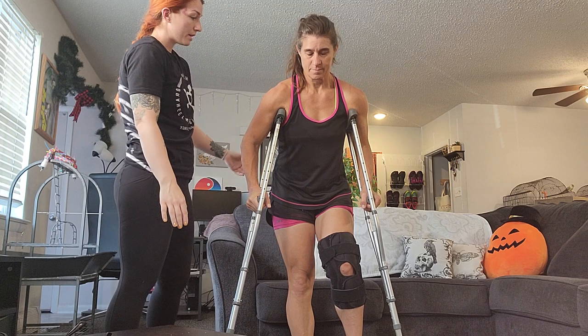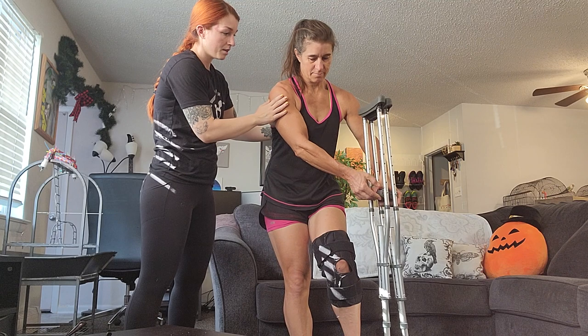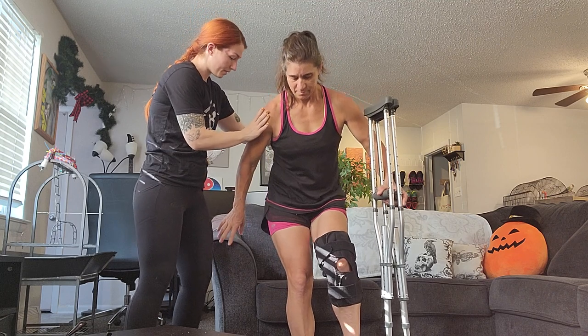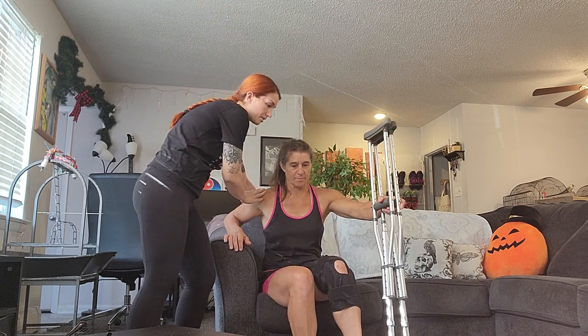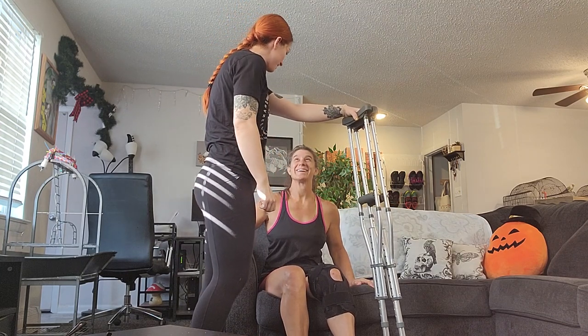So now we're gonna have you sit back down. I'm gonna support you again. Go ahead and switch this to the other side. Hold on for that brace. There you go. And I will go ahead and take that from you. Feeling good? Yes. Feeling confident? Yes.